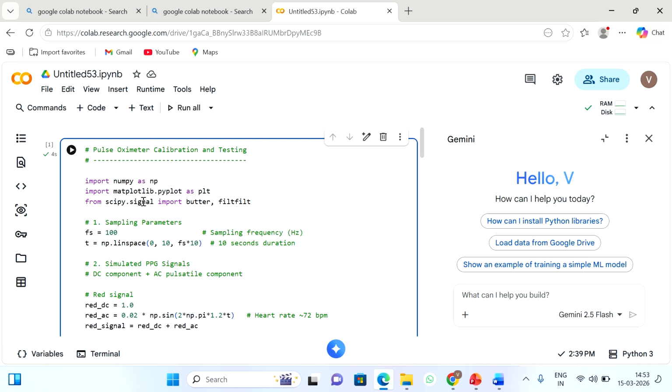And here PPG signals are taken from our body, so for signal functions, from the signal module we have to import the SciPy library, and then signal functions. There are so many signal functions, but in this experiment we need the butter and filtfilt functions.